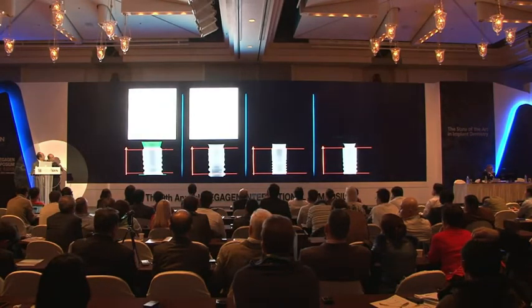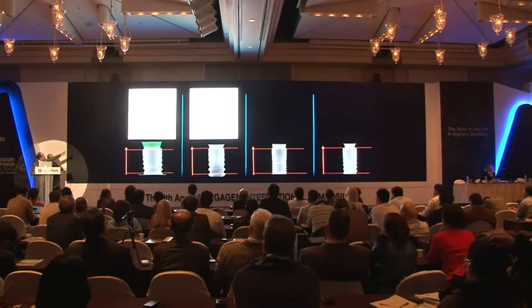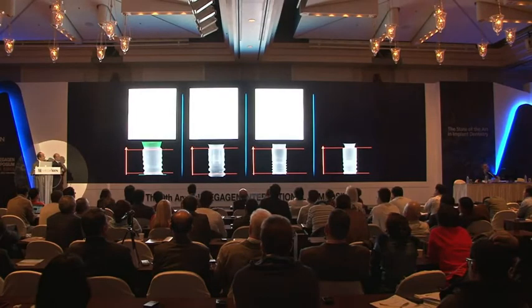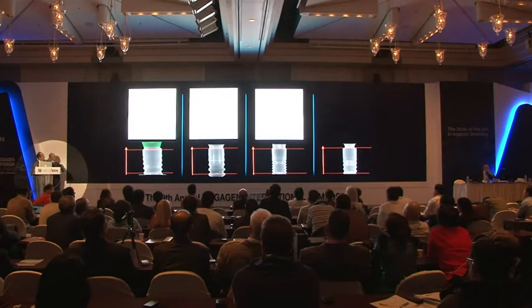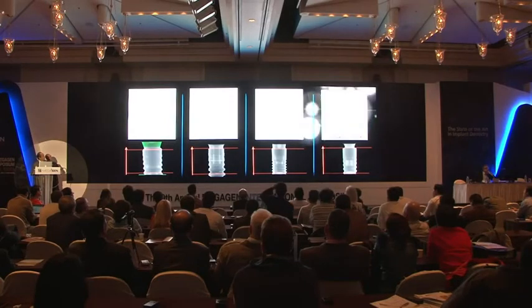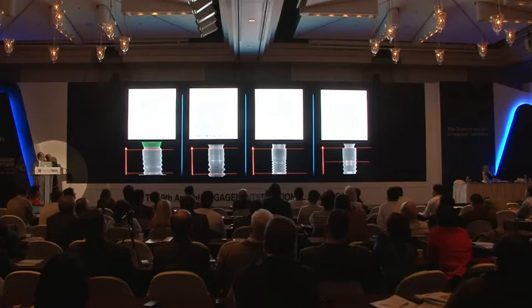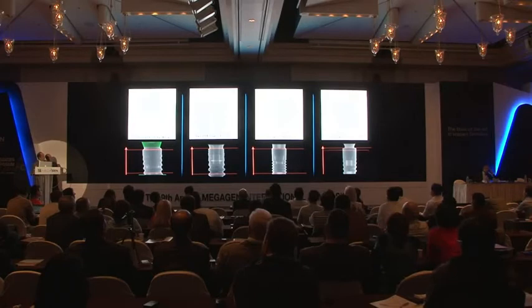The same for Straumann, we have the index, no contact in the index, now with 4 positions, and when the cone starts, now we have all gray, that means we have contact. With Astra, we have an index with 12 positions, with a white space, not working. This is the index. And when the cone starts, now we have a long gray period. That means that we have a longer cone. The same for Ankylos, where we have a 6 position index, not working. And now, when the cone starts, we have a long gray period because we have a long cone.